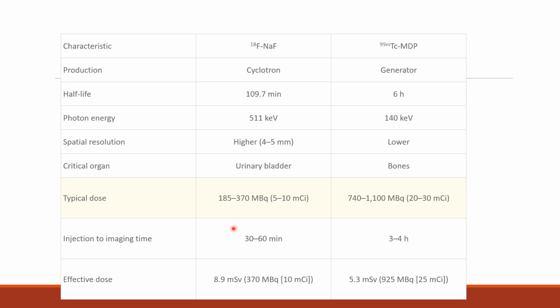It's better for patients that can't really lay around for as long or hang out for as long at the hospital or imaging center. The effective dose, though, is a little bit higher at the end of it, and a lot of that has to do with giving PET CT instead, because you're using a smaller dose and it has a smaller effective half-life. And so most of this dose for the F18 comes from the actual CT portion.